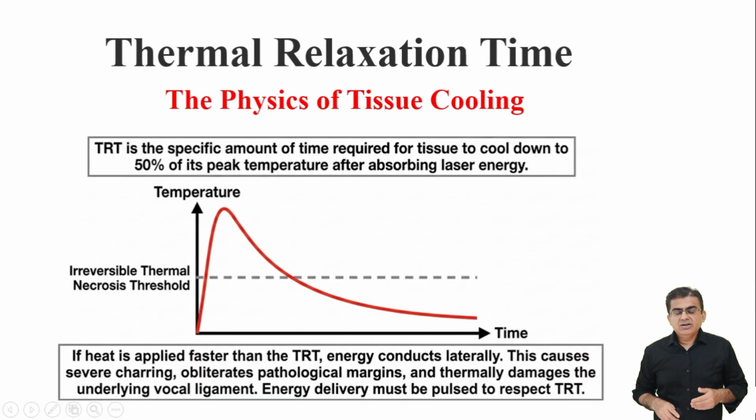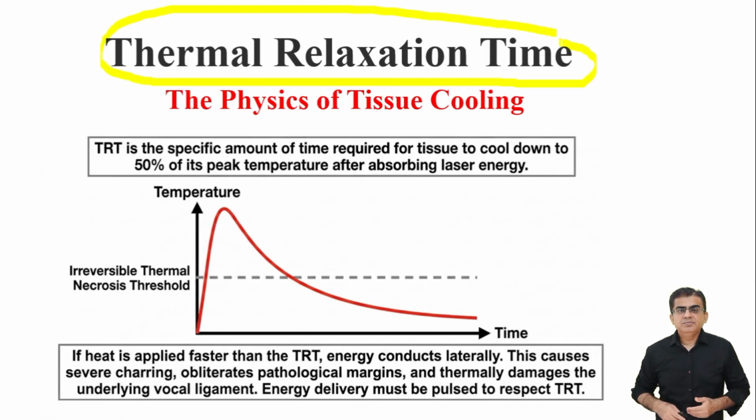Let us now discuss a very crucial concept in laser biophysics. Look at the graph on your screen showing thermal relaxation time, or TRT. TRT is the exact amount of time a tissue needs to naturally cool down. Specifically, it is the time required for tissue to cool down to 50% of its peak temperature after absorbing laser energy. Look at the red temperature curve on the graph.